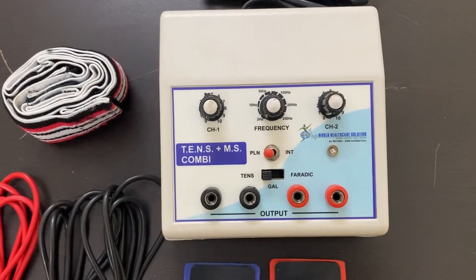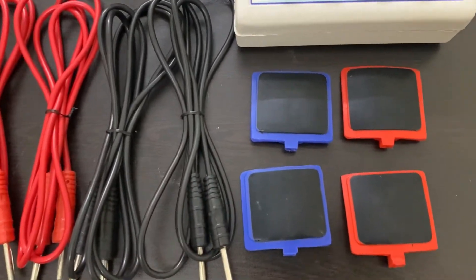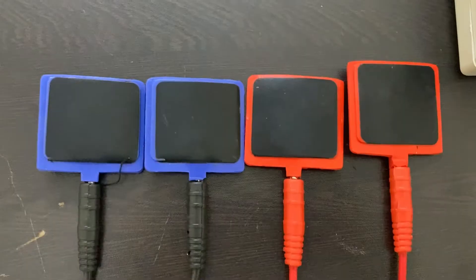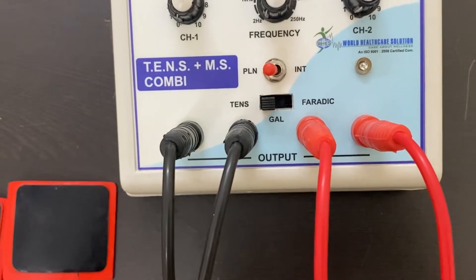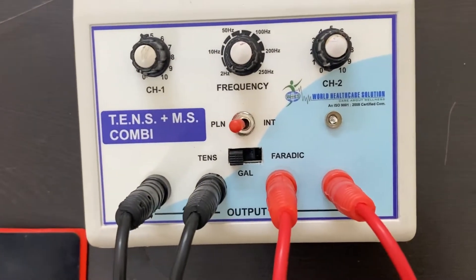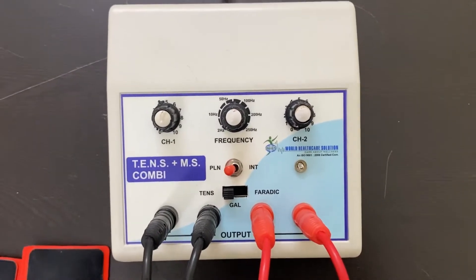To begin the demonstration, first attach all the leads with the electrodes. After connecting all the leads with electrodes, connect all the leads with the machine — the black into black and the red into red.